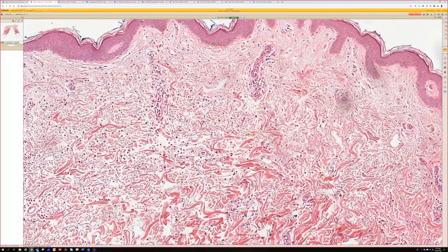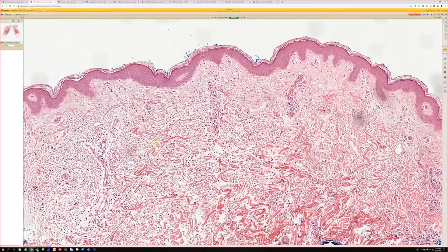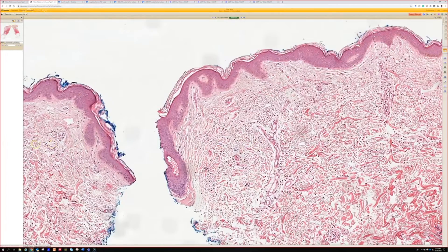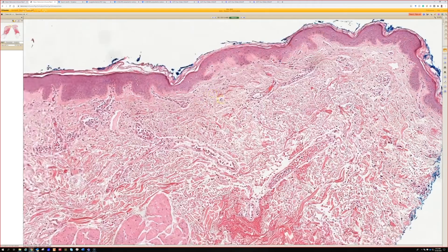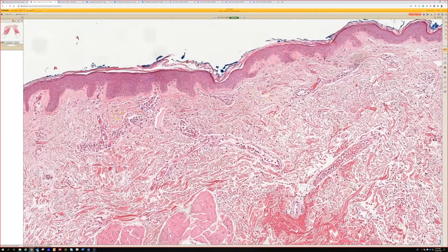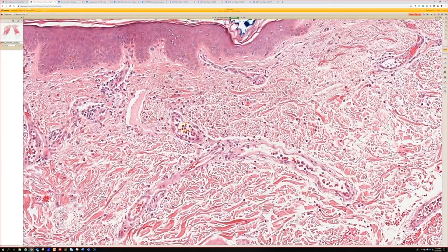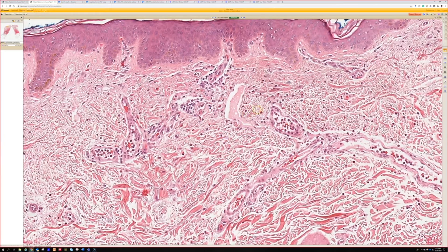So this is a great example of urticaria. I agree — this is what I like to see for urticaria. I find the vessel dilation with the neutrophils really telling. When you see a bunch of neutrophils collecting in the vessel, in these little small vessels superficially, I find that really helpful to support a diagnosis of urticaria.